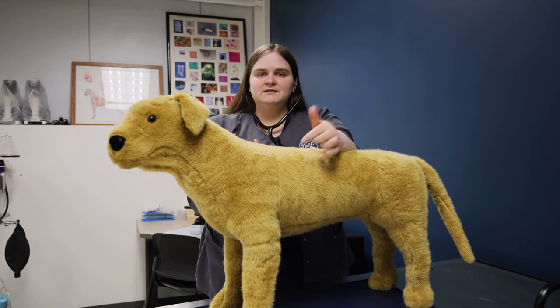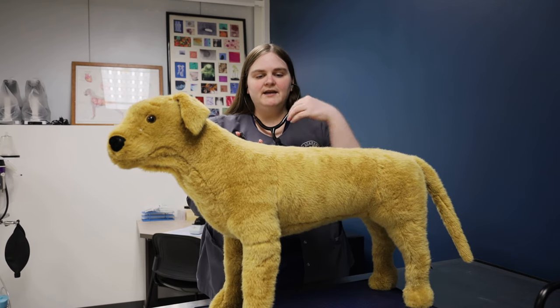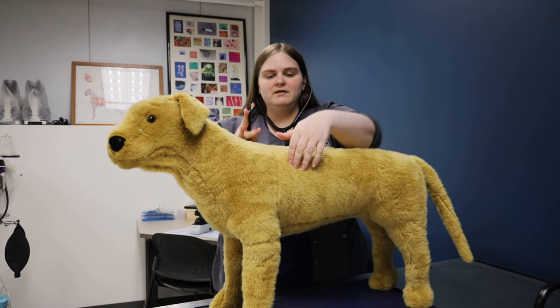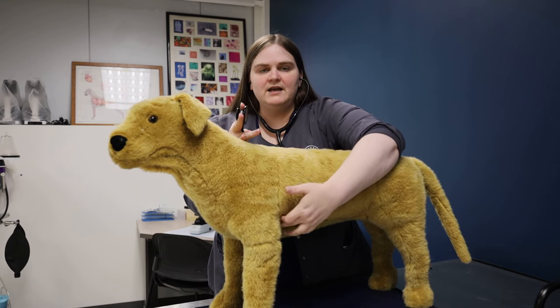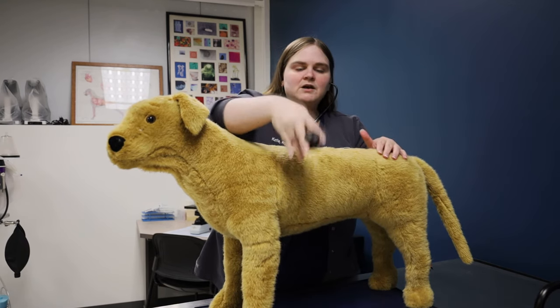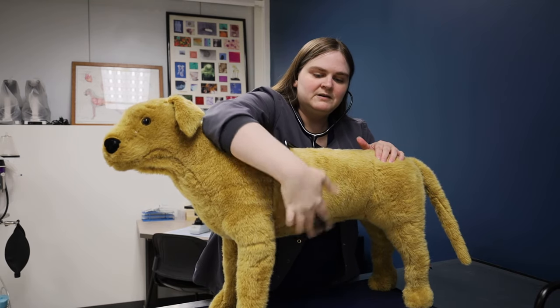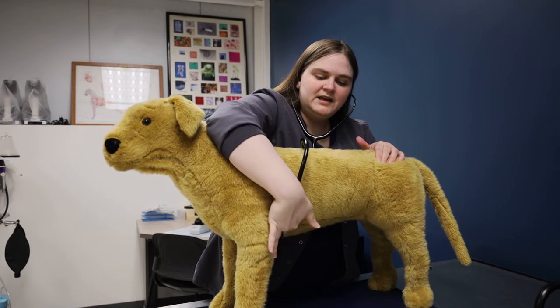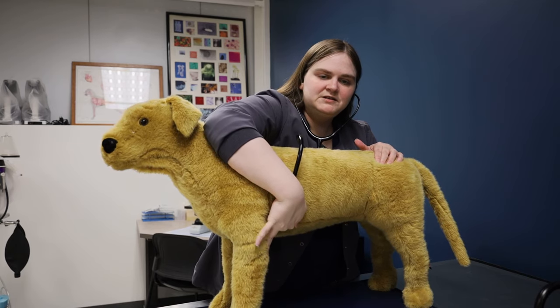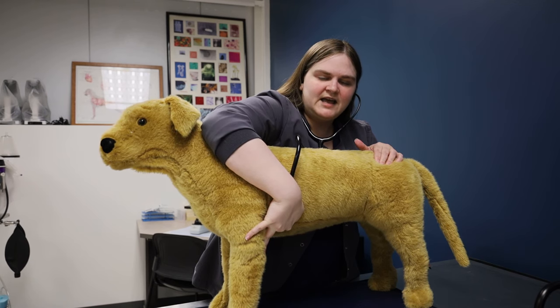Now we're ready to listen to the heart. On a dog — also on a cat — we can find the heart just behind the elbow in our armpit region. We can find it two ways. We can go just in the armpit region right here, and if you're not hearing it right away, just go deeper into the armpit. Some dogs have a lot of skin in that area, so you just kind of have to push into that area.